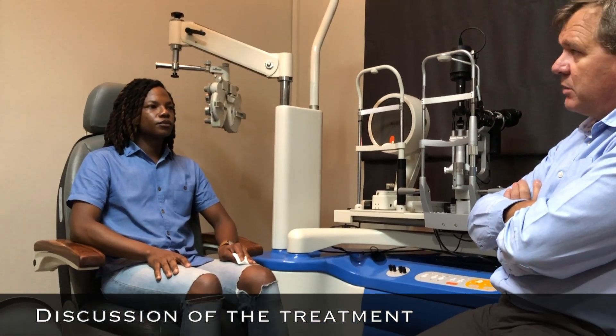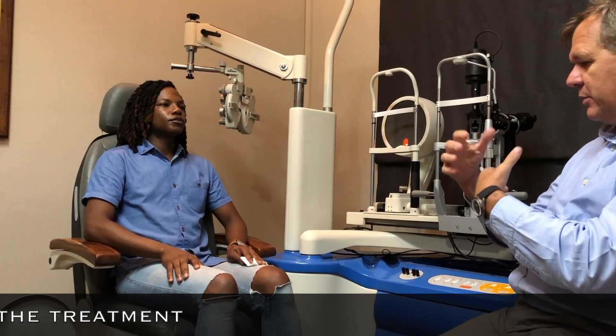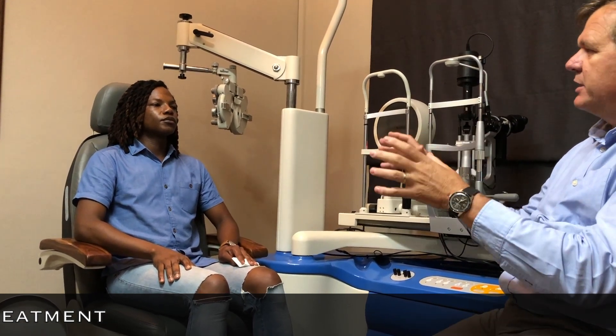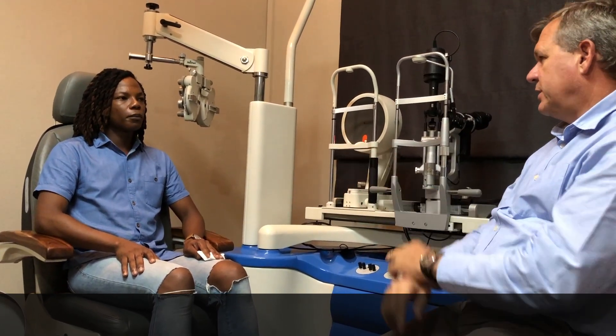Your solutions to clean them will cost you probably about 50 Rand a month. In terms of the scleral lenses — the newer, bigger lenses — they're more than double the price of these, and they're not as healthy. Because the movement this lens has means there's continuous change of the tears between the lens and the eye. With a scleral lens there's really no tear exchange, so oxygenation and health of the cornea is better with RGPs. For some people, scleral lenses are more comfortable because they're bigger and the eyelid doesn't feel the edge.